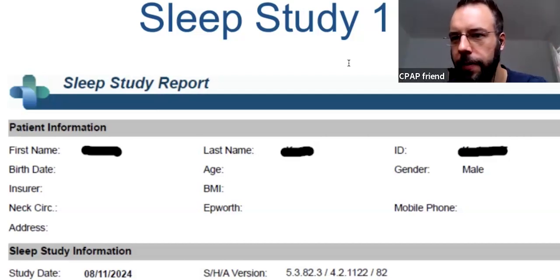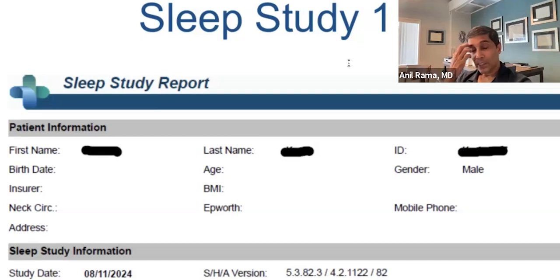Box. All you need is a AAA battery that's brand new. Ideally, you have a piece of medical tape because it asks you to adhere something over that tape. Maybe later you can add the 4-minute how-to-use-a-WatchPAT video that's on your YouTube channel, and include that in some way, and people can see how easy it is to do. And then you put in a PIN number, and we always use one same PIN number to make it easy, and they're off to the races. We use the WatchPAT 1, which means it's disposable, so they don't even have to return it. There's no inventory to manage.